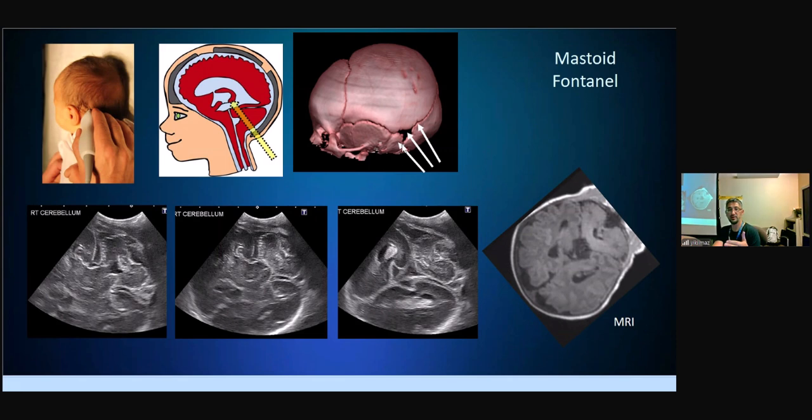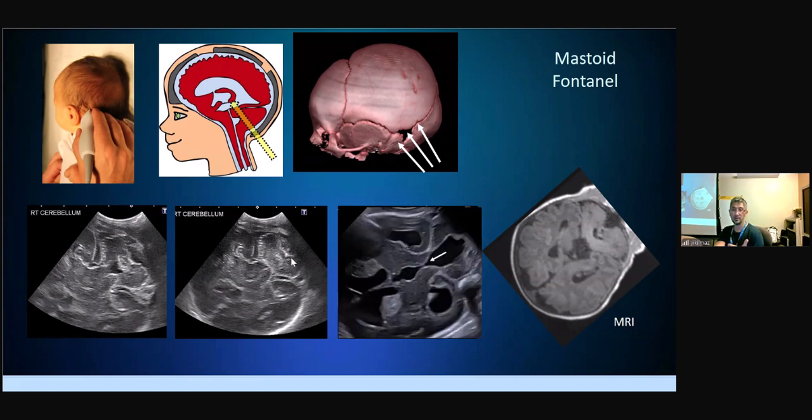The mastoid fontanelle allows assessment of the posterior fossa nicely. It is right behind the ear. You put your probe, you get oblique coronal views, and I put the MRI correlation here. Oblique coronal views are basically for cerebellum and posterior fossa structures, at least 2 images, including the fourth ventricle. For example, you can see the third ventricle here, fourth ventricle here, and you can see the aqueduct of Sylvius nicely, which is very tiny, and you can see even tiny clots by using ultrasound here.